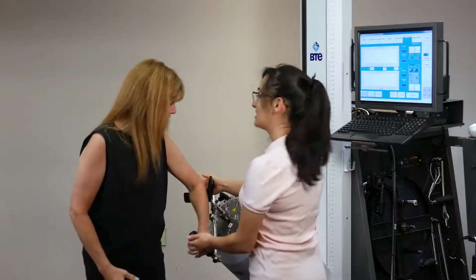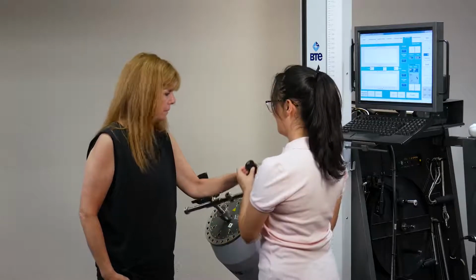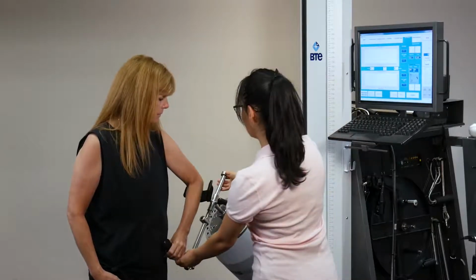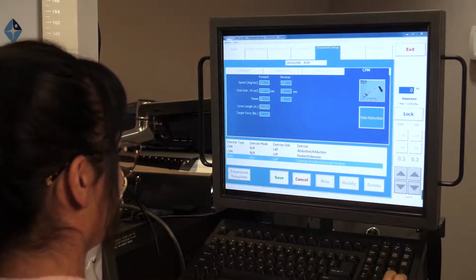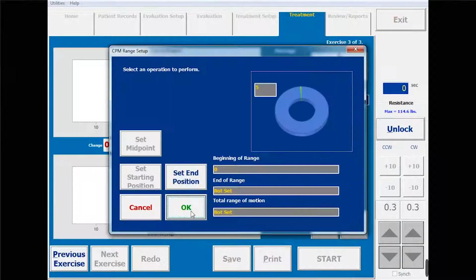Let's get started. CPM with target force can be really beneficial for ortho and neuro patients or people who are arthritic or frail. Today we're going to do CPM with target force for the shoulder and elbow. You can also do it for the upper and lower extremities. So before we start exercising, we're going to define the target force after proper dosing. And we'll set the speed and the client's current range of motion. Now we're ready to start CPM with target force.